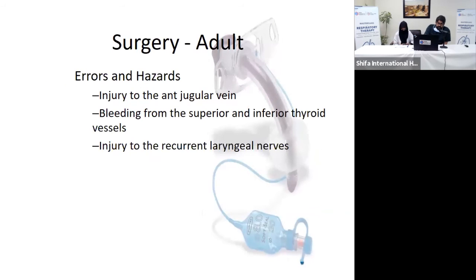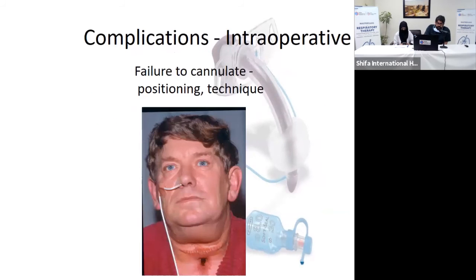Bleeding is one of the complications which we are worried about. And second is injury to the laryngeal nerve. Sometimes you can even have pneumothorax after doing tracheostomies if you're doing a bit low tracheostomies. Sometimes you cannot put the tube in. You find it, but you cannot put it in. And this has happened to me, doing tracheostomies. You thought it'll be easy. We are in theater in an all controlled environment, and the tube didn't go in or it made a false track.